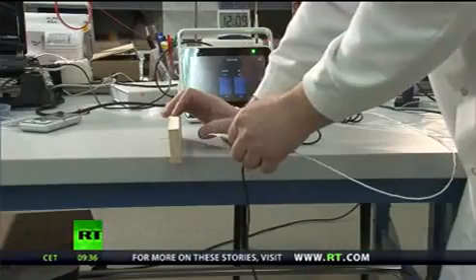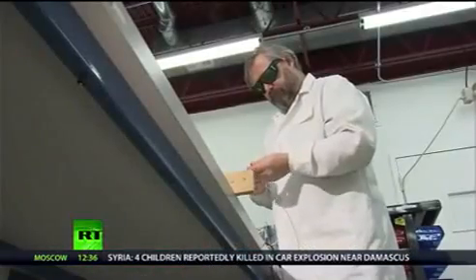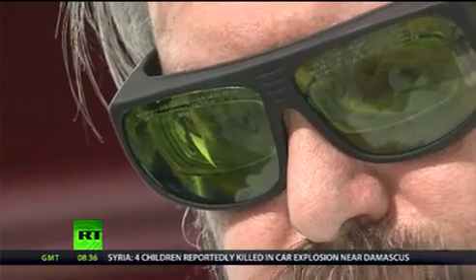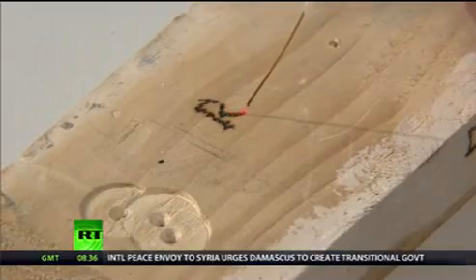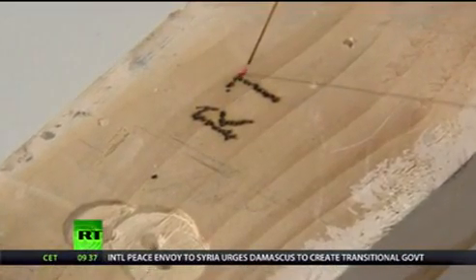As you can see here, the laser scalpel is easily able to pierce a piece of wood. With only 3 pulses, it can slice through about 15 millimeters. The resulting hole is smaller and more accurate than is possible with other surgical drills. In theory, such super fast pulsating power could be used for painless cavity drilling.